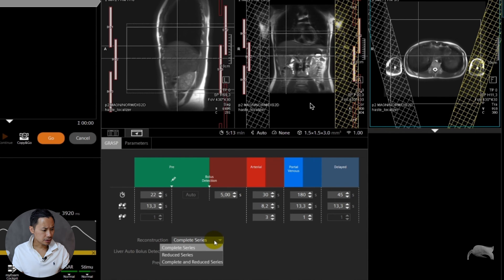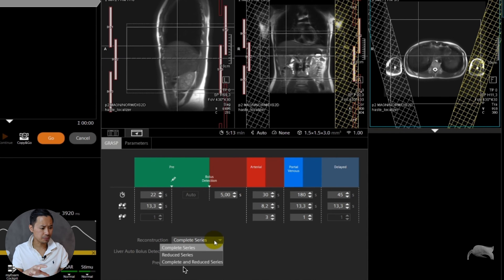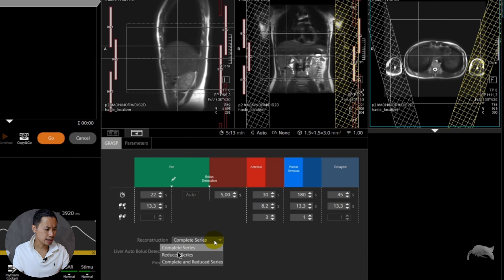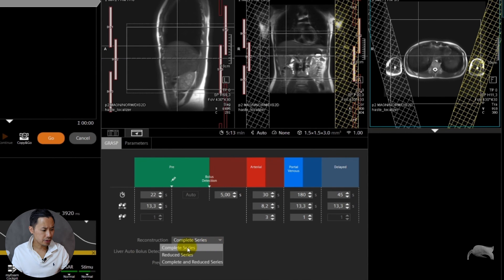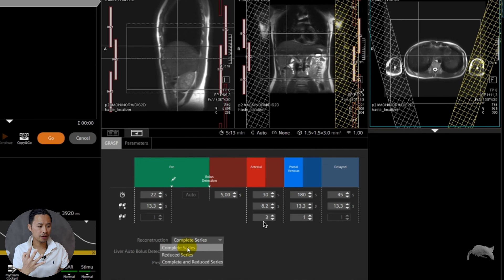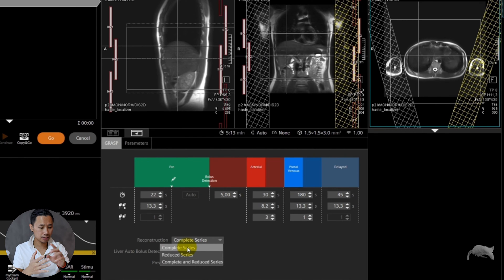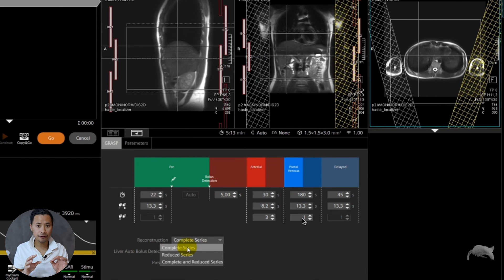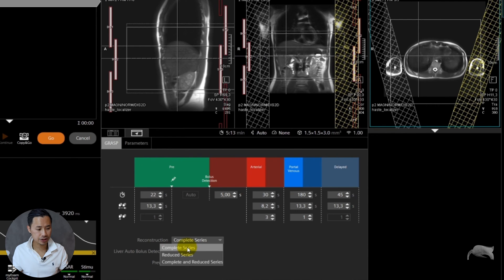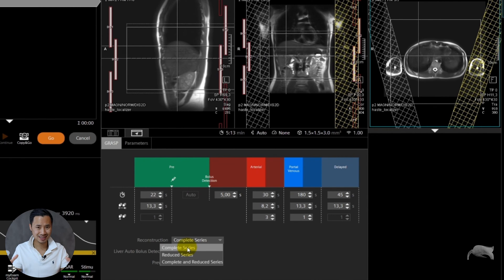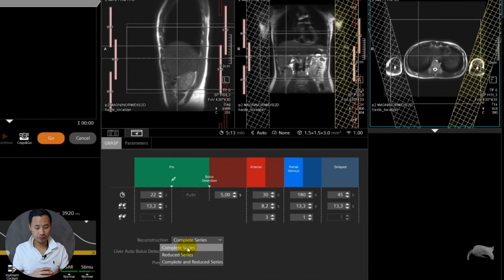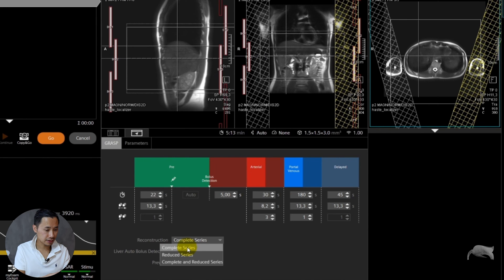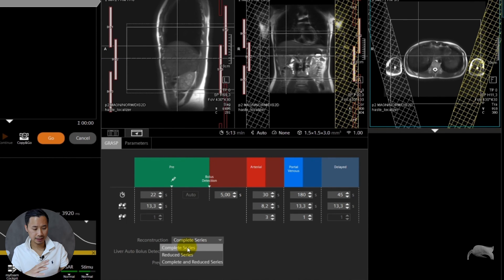Here in the reconstruction you have something called complete series, reduced series, and complete and reduced. Let's walk through it. Complete means you will have everything. Remember earlier I told you there's room for four arterial phases? The scanner will give you four arterial phases. When it comes to the PV it says 14, but I only order one here, so it will give you 14 images. It gives you a lot of images with the whole stack. The radiologist would have to look through a lot of images, maybe unnecessary images, and it would take a lot of room in the PACS and in the scanner.